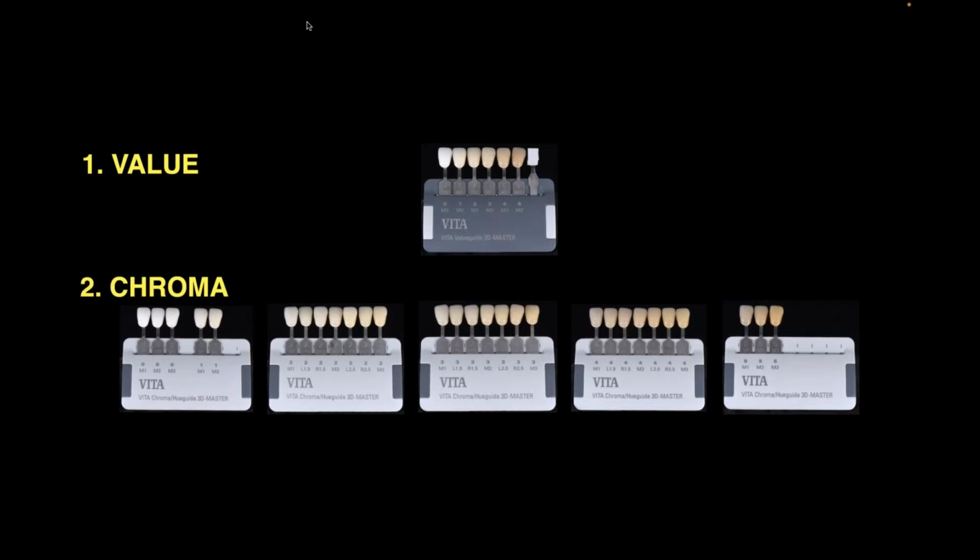Now, be clear, when I'm choosing my value, which I said is not really the right way to start, I'm choosing it based on the first thought of what is the enamel that I'm working with? Is it transparent? Is it milky? Is it translucent? Once I know what that is, then I go back and look for the basic value of the tooth. And the reason that I'm doing that is because sometimes when I have a very translucent enamel, it means that the value that I see inside might not be the appropriate shade to use.